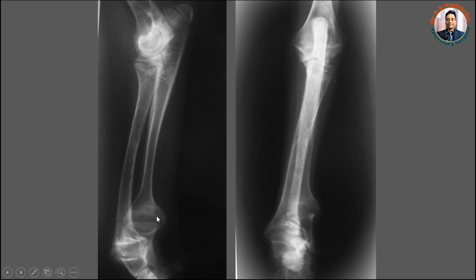This widening is of such a shape that it appears as if it is a mushroom. That is why, when there is a mushrooming of the distal metaphysis, we say this is a radiographic feature of rickets. You could also call this cupping. So cupping or mushrooming of the distal metaphysis of the radius and ulna in case of the young animal is suggestive of rickets. This mushrooming or cupping of the distal metaphysis is not very clear here, and it is basically hazy in nature.